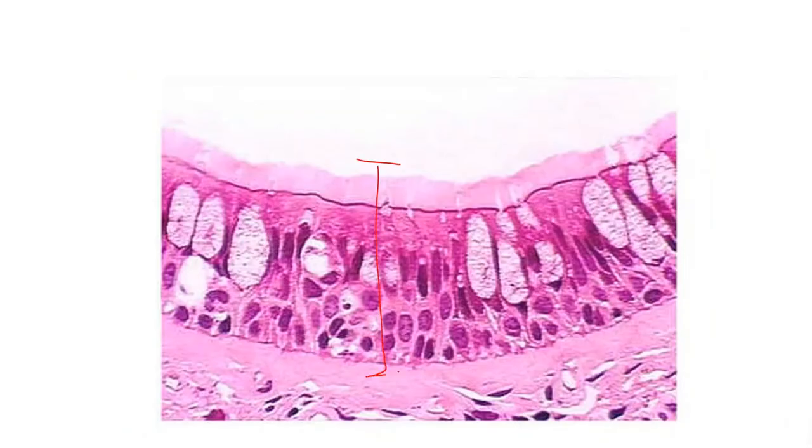From here to here, again, apical surface, basement membrane, connective tissue underneath. This has got to be epithelium, but what type? Well, I see goblet cell, goblet cell, goblet cell, goblet cell. I see some ciliation. If I shot this tissue with an arrow, I missed a lot of the nuclei. So it looks stratified, but it's falsely stratified. This is another pseudostratified columnar epithelial slide, and it is ciliated as well.